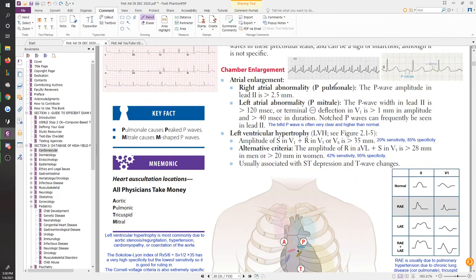Atrial enlargement stuff has shown up, and it's very similar to the William Marrow stuff we were looking at, because once again you'll be looking for the M's and W's, and thankfully they're pretty apparent. So you could either have right atrial abnormality, which is a right atrial enlargement, which would happen in a person who maybe has pulmonary hypertension, right? So they call this P pulmonale. The P wave amplitude in lead 2 is going to be very tall, right? So you can see that, right?